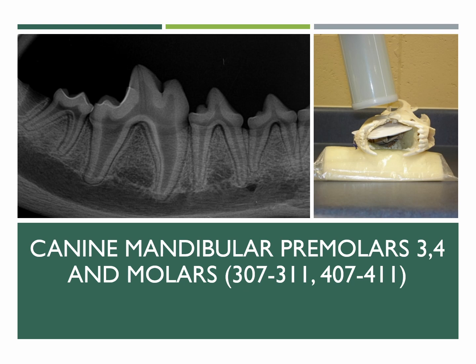Okay, and that's what it kind of looks like. So you can see here the tube head is parallel, right? Because we can actually get parallel, and we can get right down to that root. And that's what your teeth kind of look like when you get that view.